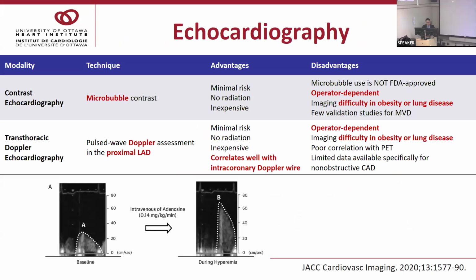As for echo, there are 2 approaches: contrast echo and Doppler echo. The contrast echo has very few validation studies for CMD, unfortunately, whereas the Doppler echo-based measurement was shown to correlate well with invasive measurement. However, just keep in mind that only the LAD territory can be assessed with this technique, so applicability would be very limited. And obviously, echo-based measurement is highly operator-dependent and affected by the patient's body habitus.